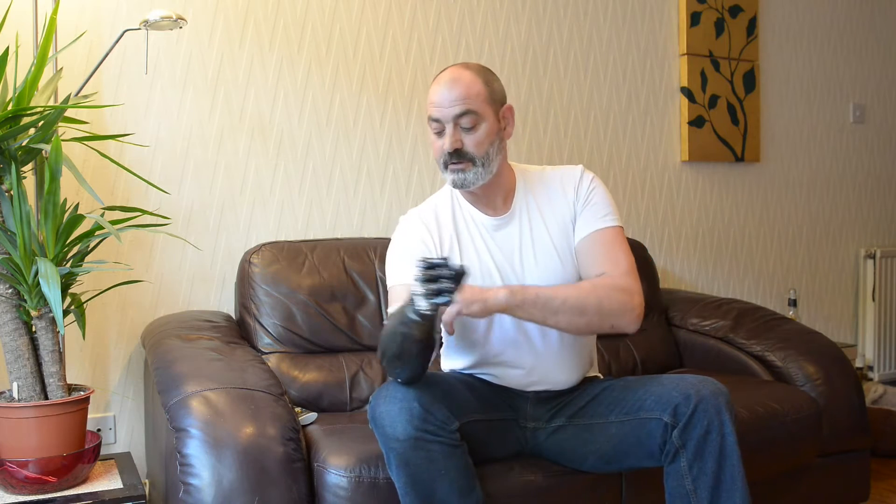Hi, I'm Nigel. I lost part of my arm in an accident at work a few years ago. Since then I've been fortunate enough to be given one of these to trial. This is the Be Bionic V3 — it's a prosthetic hand and it works from sensors on the inside and outside of my arm and muscle control.